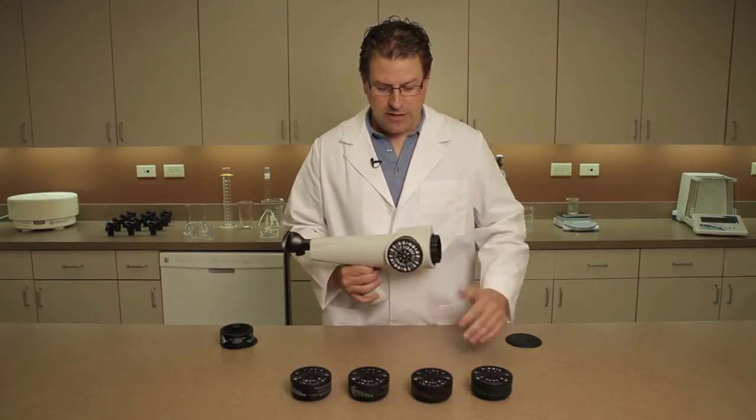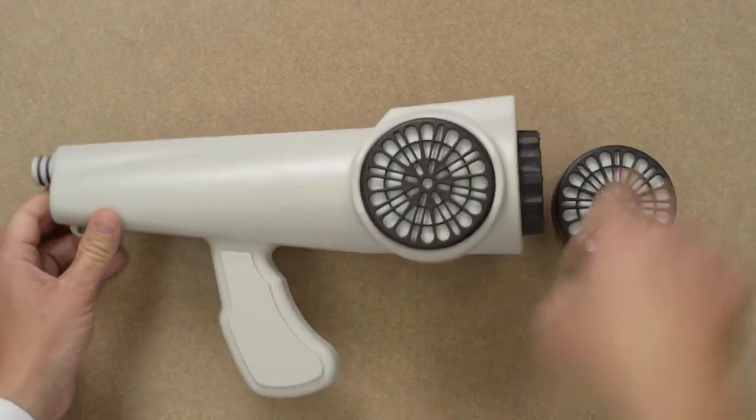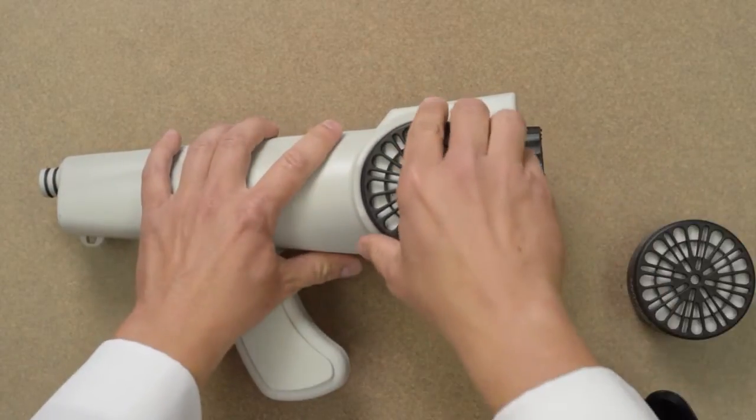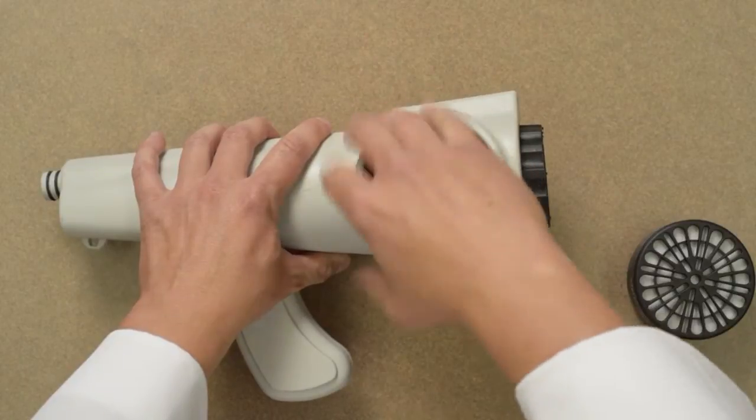To replace any of the cartridges, set the Nasal Ranger on its side on a flat, stable surface. Grip the Nasal Ranger around its main body and then loosen the cartridge by turning it counterclockwise. Continue to turn the cartridge until it's free from the housing.